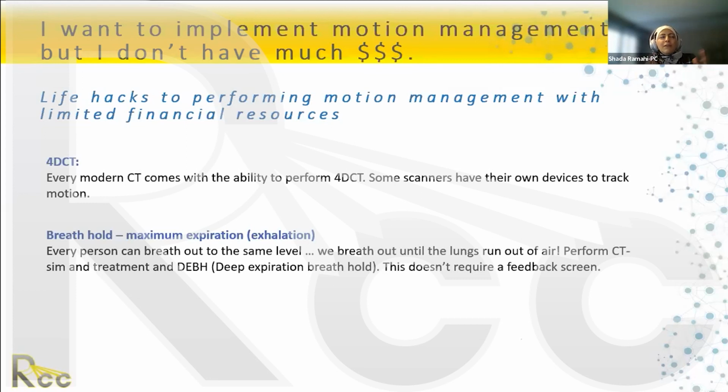So if you don't have anything else except your CT sim and its ability to give you the 10 phases of 4D CT, go ahead and analyze it. And then you can make a decision, do you want to use the ITV for the SBRT treatment or not? That becomes your own clinical protocol.